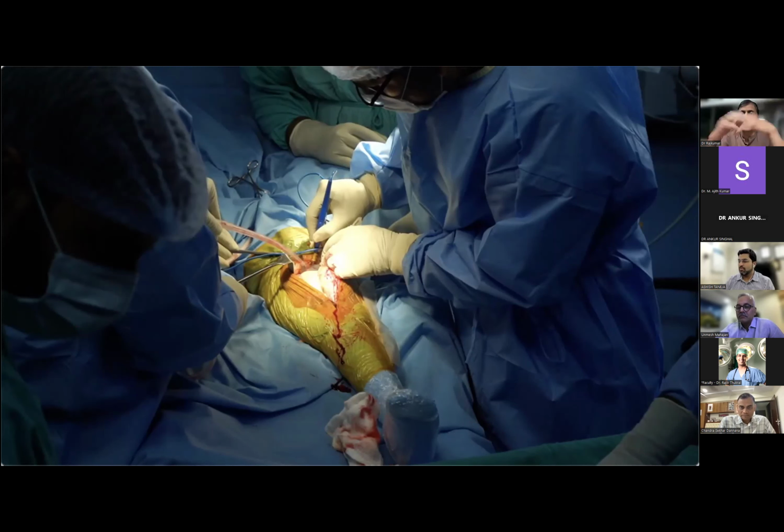When you get the second revision, you don't have the issue with the movement. So in 6 weeks or 2 months, if you are doing the second stage, I don't think static has any issue with movements. But in regard to control of infection, stability and soft tissue healing, with the static spacers, even myself, I'm feeling some good difference. So I have now moved towards static spacers.